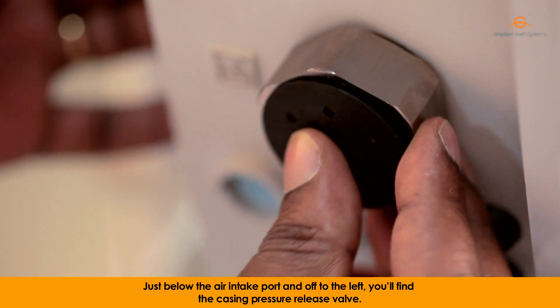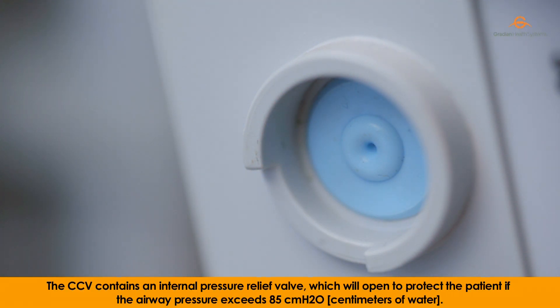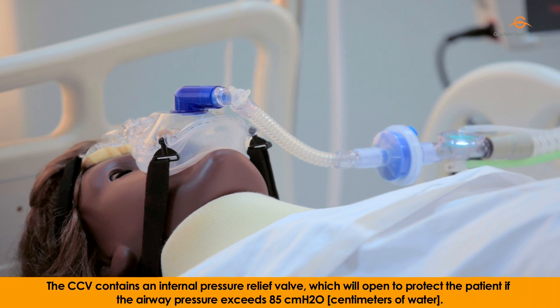Just below the air intake port and off to the left, you will find the casing pressure release valve. The CCV contains an internal pressure relief valve which will open to protect the patient if the airway pressure exceeds 85 cm of water.